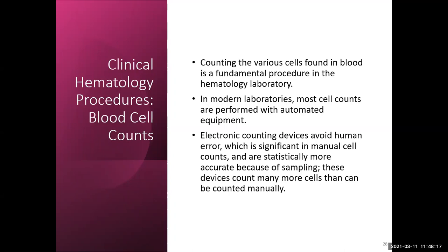And then sometimes you have patients where it'll run through the analyzer 3 or 4 days in a row. It never detects anything. And then all of a sudden one day it detects one thing and you look at it under the microscope and they've got a parasite in there. So the techs aren't always 100% accurate. The machines aren't always 100% accurate, but you're going to learn when you're in hematology ways to help detect some of those errors.